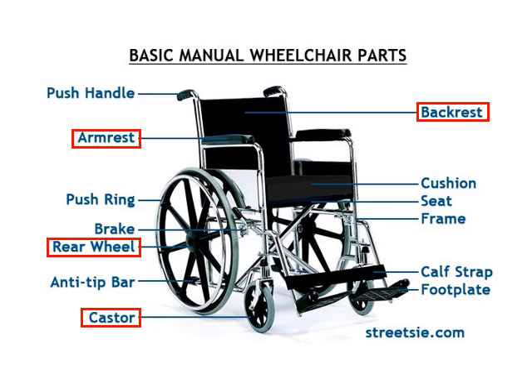There are armrests. Sometimes they're removable, but sometimes they're welded into the frame, which doesn't help very much with adjustments. You can have armrests that flip up and out of the way. You can have armrests that completely detach from the wheelchair, and those could be important if somebody needs to transfer using a transfer board, which we'll learn about in one of our labs.